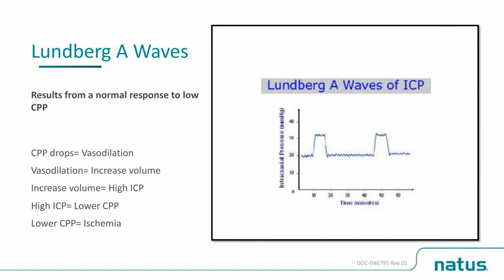Lundberg A waves, or trend, is a cycle of plateaued increases in ICP. If you were watching this happen at the bedside, what you would see is an increase in ICP that would sustain for somewhere around 5 to 10 minutes and then relent back to where it started. And minutes later, it would elevate again, sustain the elevation for a matter of minutes, and then go back to where the ICP started. They are also sometimes referred to as plateau waves, because the trend, when put together, creates these plateaus like the ones pictured in this slide.